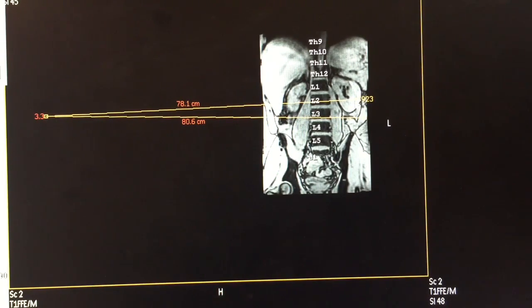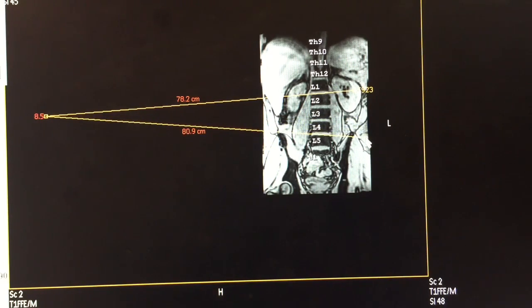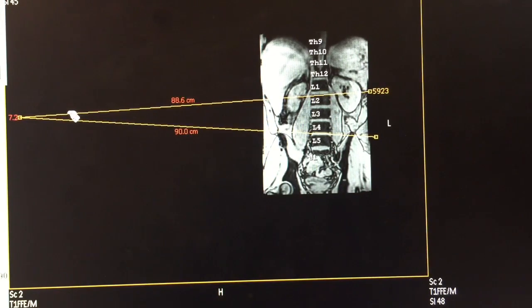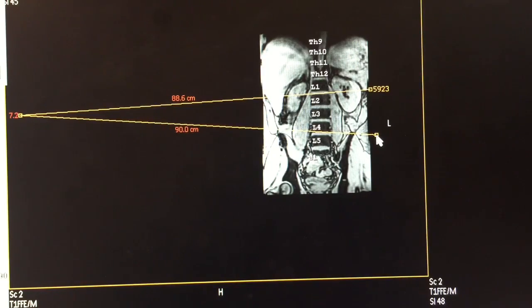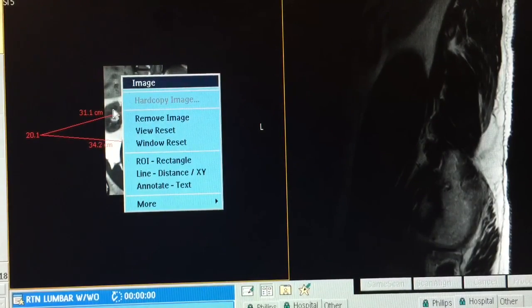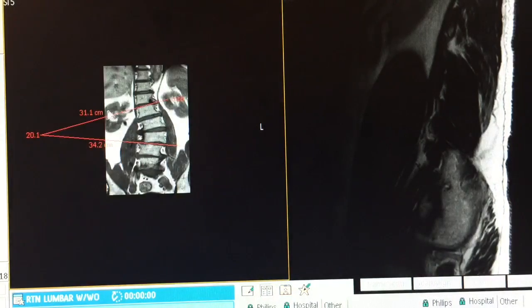Here's my measurement — approximately 8.5 degrees, which is less than 11. So I won't need to run my coronal T1 in this case. I can extend it even further for more accuracy, but at this point it's clear I don't need to run my coronal.